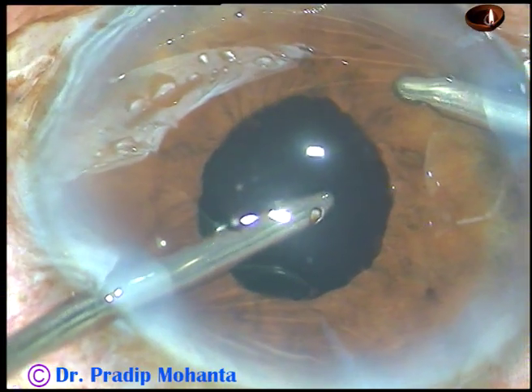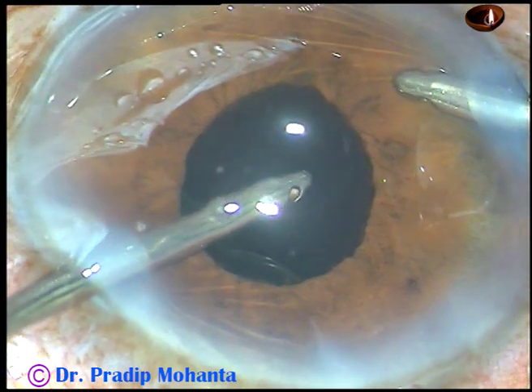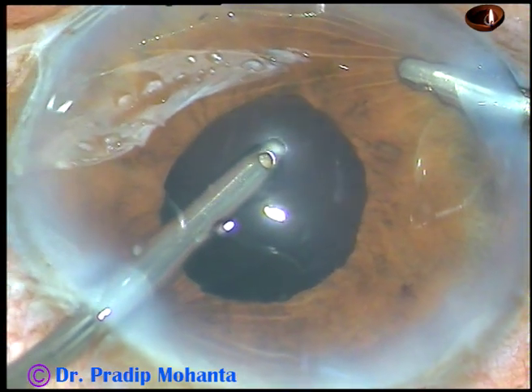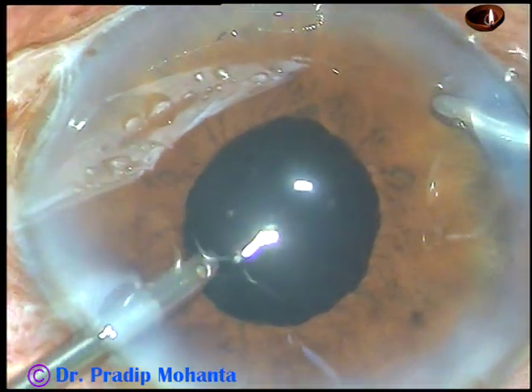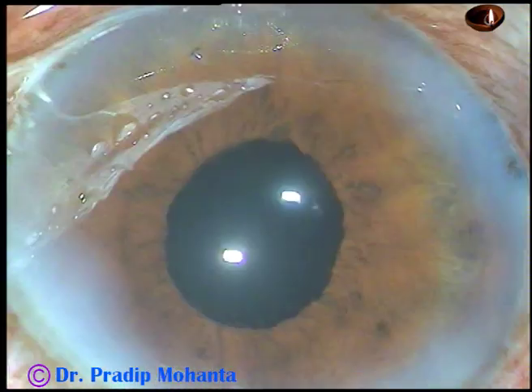And now, clean the viscoelastic substance thoroughly by bimanual irrigation-aspiration. After this, close the wounds by hydration and you get a very nice pupil.